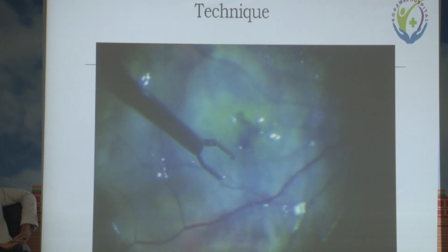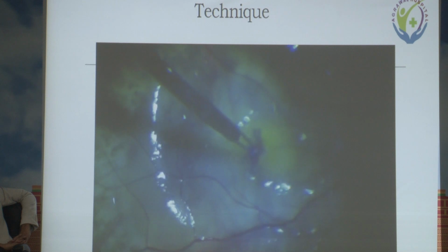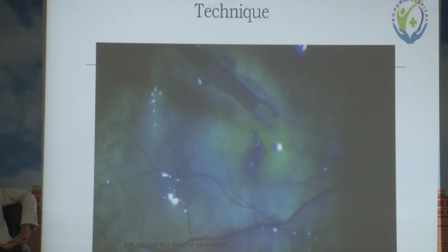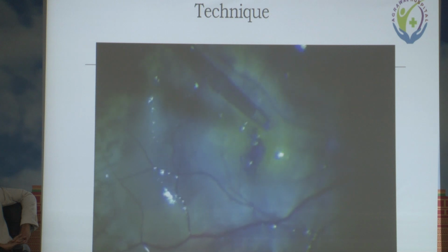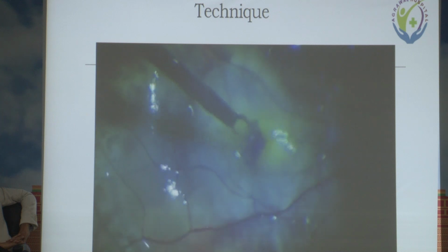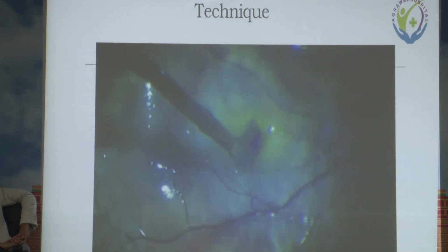We don't exactly stuff it inside the hole, just give it a gentle tug. And again, the common point is that the area of the peel should be wide enough to include the curvature of the staphyloma. If that is not done, the retina will not be pliable enough to get settled, and the hole will not close in the post-operative period. After that, the whole ILM is bunched towards the hole, and the PFCL bubble is gently aspirated.